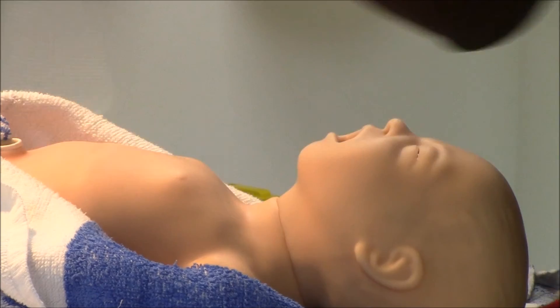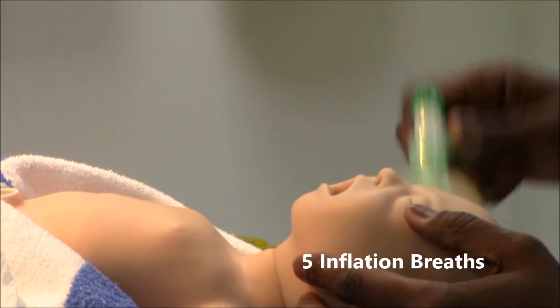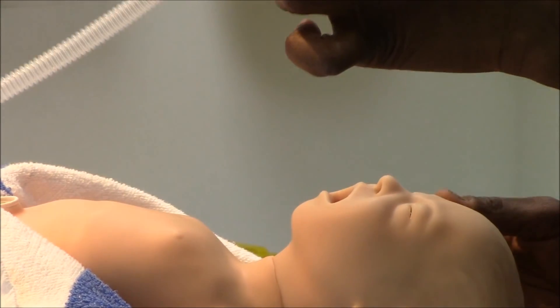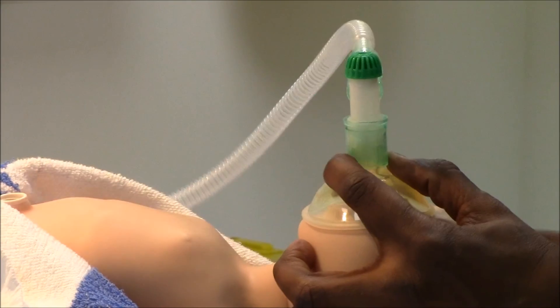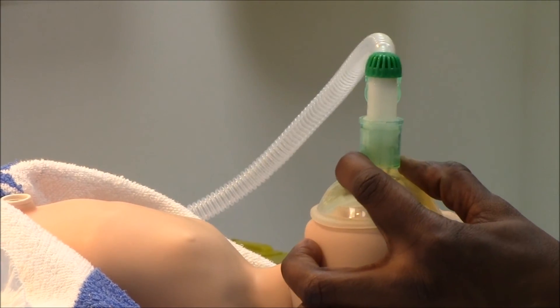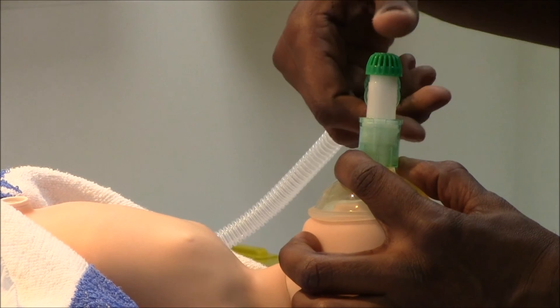I am going to give a set of 5 inflation breaths. Head in the neutral position, I am going to use my C and E position, roll the mask on, support the airway, still in the neutral position. 5 inflation breaths, each one over 2 to 3 seconds.